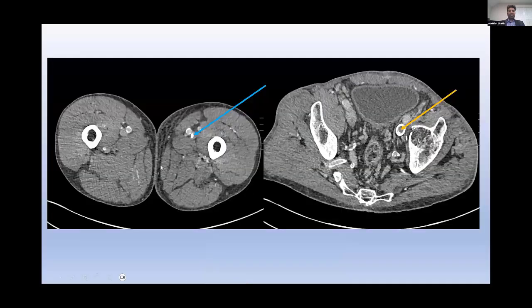On axial images lower down, you can see the patient is symptomatic. There is subcutaneous edema in the proximal left thigh. There's a blue arrow pointing to calcium within the superficial femoral vein. And axial imaging in the pelvis points at the stent, and you can see the material within it.